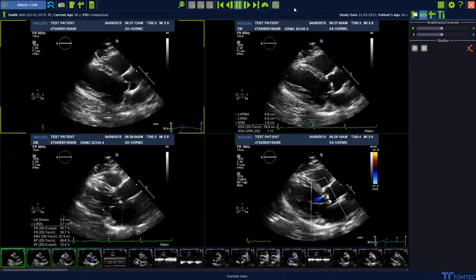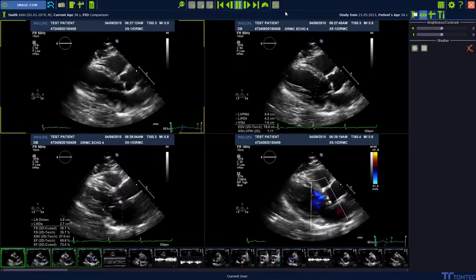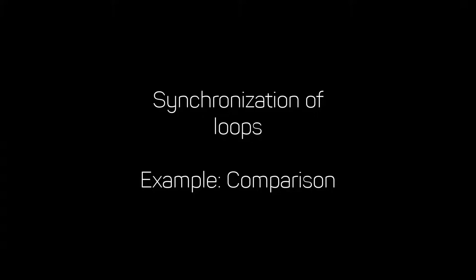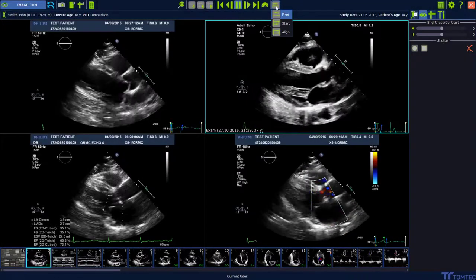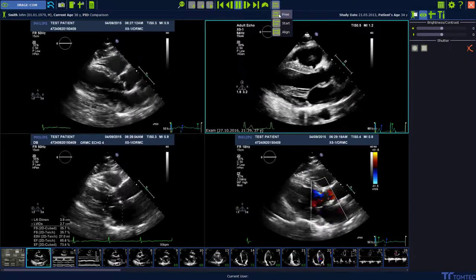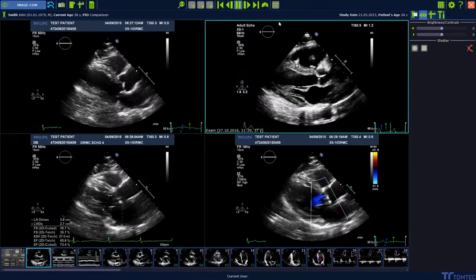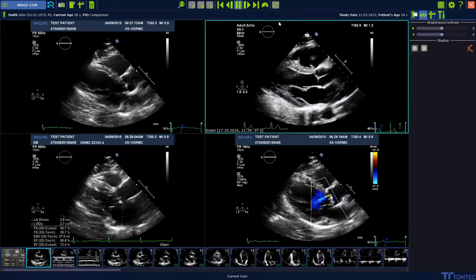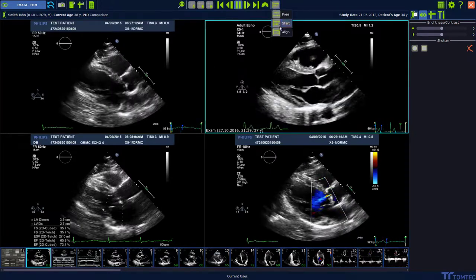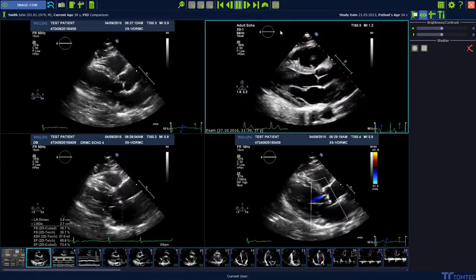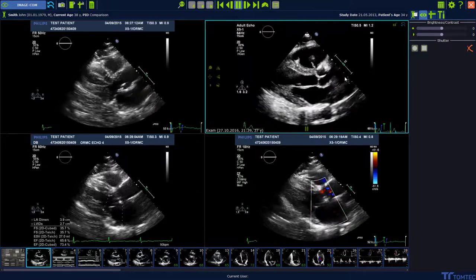The last option of the toolbar shows the synchronization of loops — for example in comparison mode. Free means no synchronization, start means all clips will start simultaneously, and align means all loops will be managed in order to start and end together.